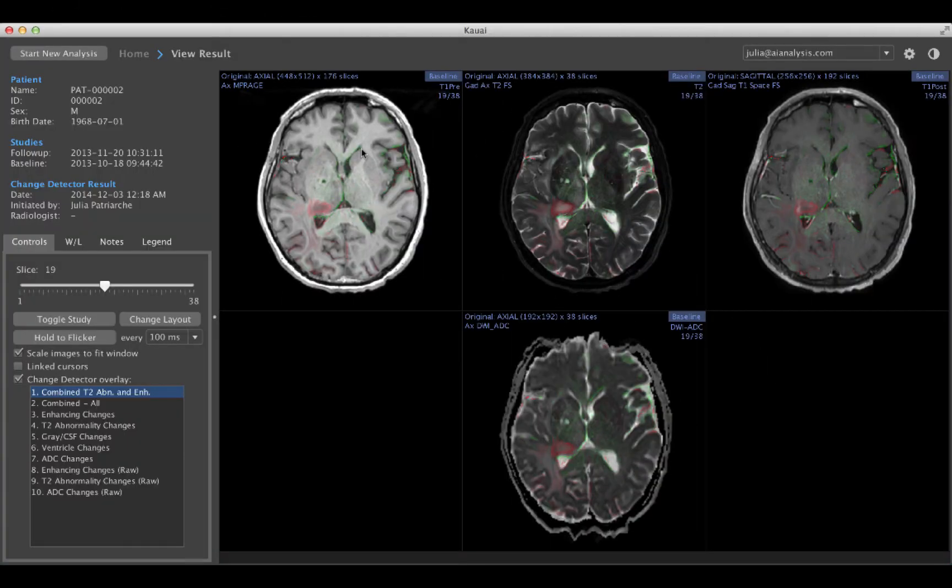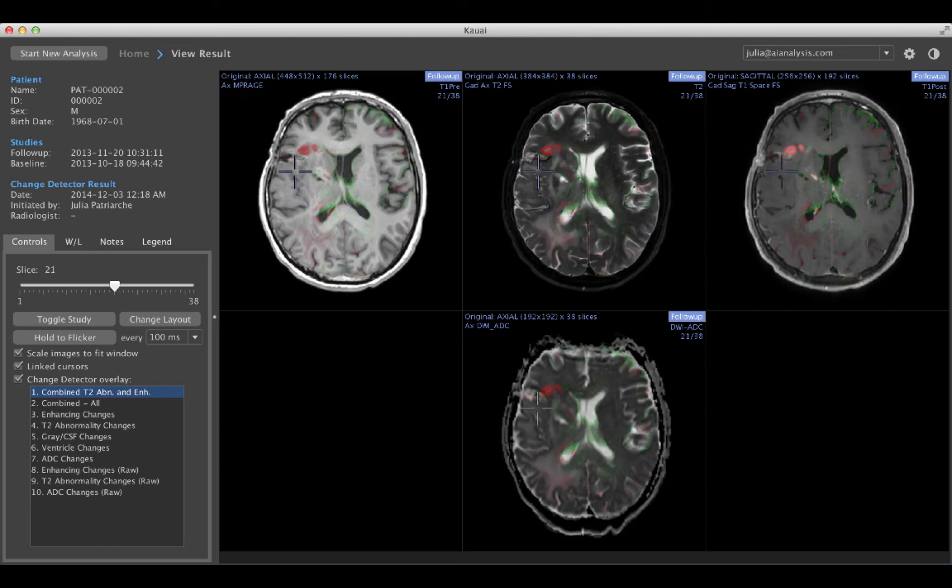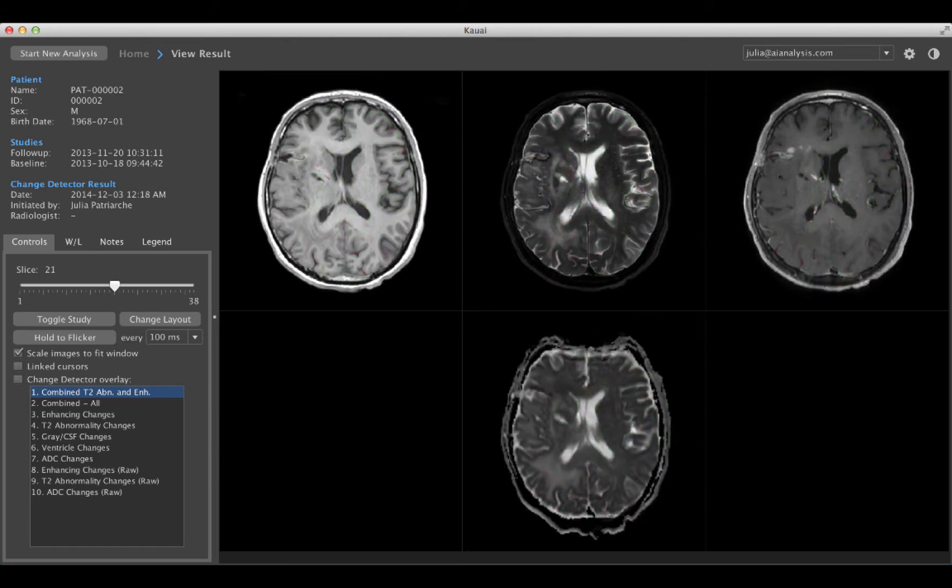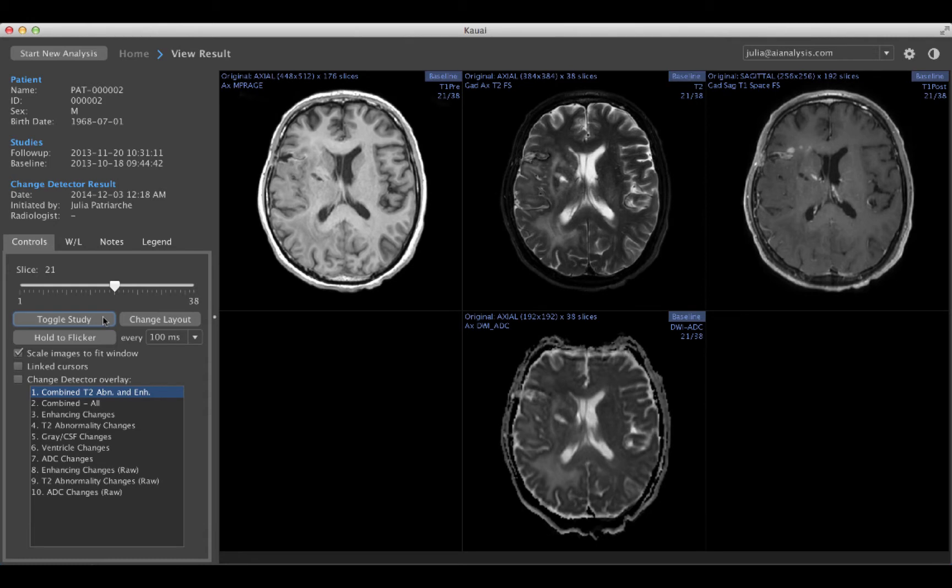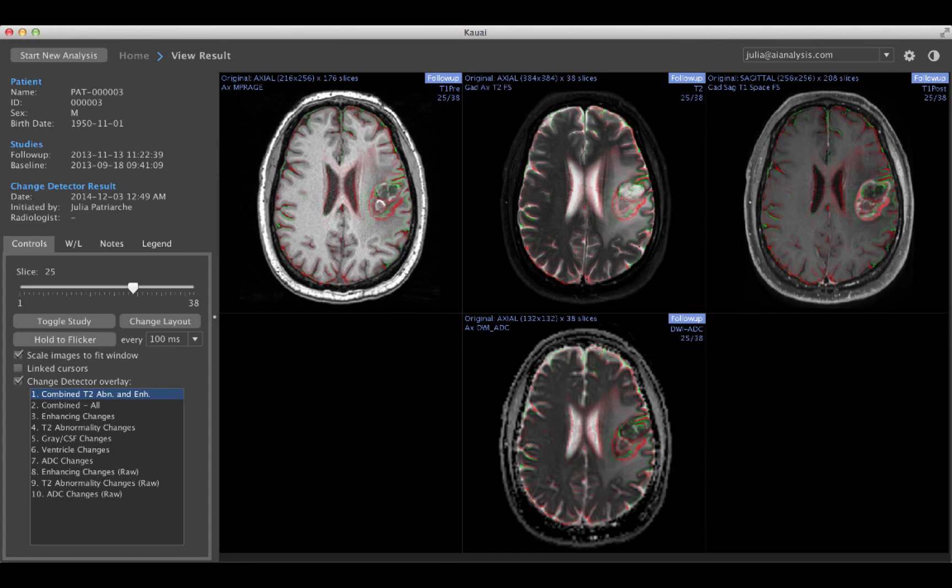The Kauai Change Detector provides a suite of computer-aided diagnostic tools to help you perform serial comparisons by matching what is presented to the way the human visual system actually works. The Kauai Change Detector toolset includes automatic registration of all images, linked cursors, flicker between baseline and follow-up images, toggle between baseline and follow-up images, and a color-coded change map that shows you what is changing, in what way, and by how much.